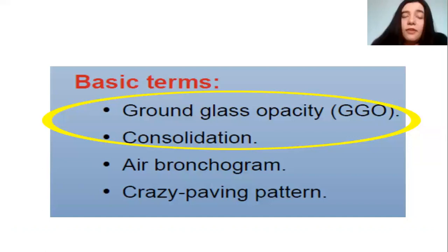This is a progressive alveolar filling which produces the ground glass opacities. Other diagnoses that can give ground glass opacities include infection, edema, diffuse alveolar damage, hemorrhage, and aspiration. Even some chronic cases like sarcoidosis and alveolar proteinosis can produce this pattern.